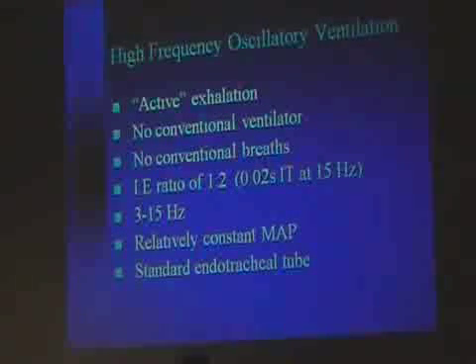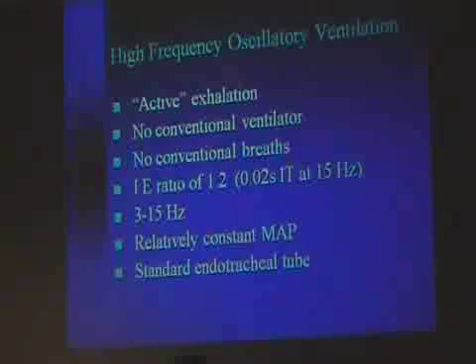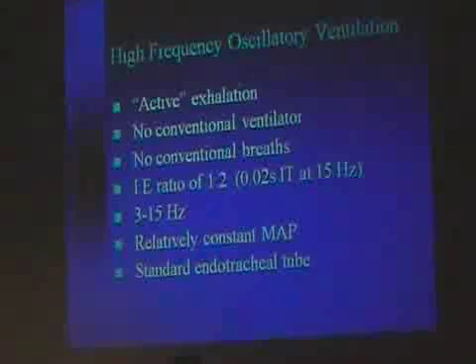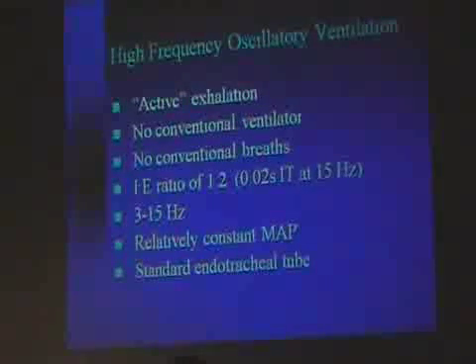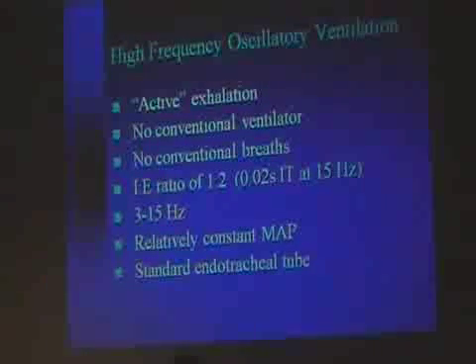That means that no matter what hertz you're using, the inspiratory time of the cycle, and remember, this is where we start using the things we learned about conventional ventilation. Remember, we have an I time, we have an E time, it all goes into the mean airway pressure. So when you're setting that 33% inspiratory time, it means 33% of the cycle, the push in and the pull out, is inspiration, and the 67% of the time is expiration. That will then vary in terms of the actual time depending on the rate that you set.